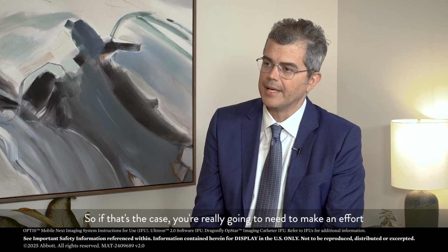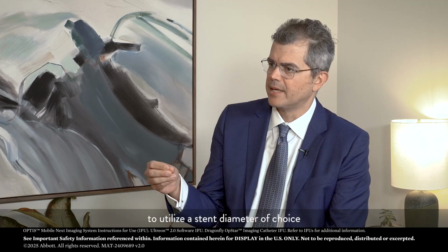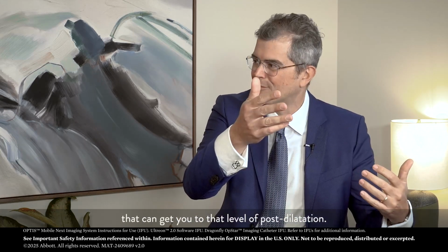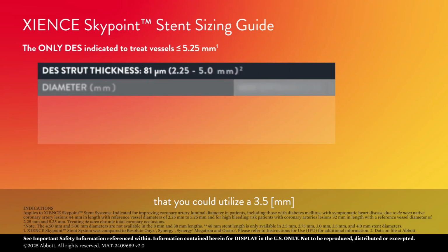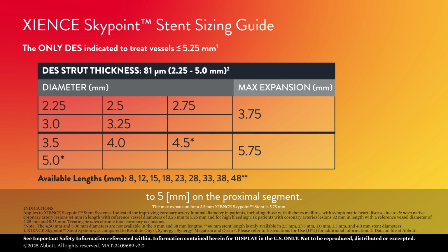If that's the case, you're really going to need to make an effort to use a stent diameter of choice that can get you to that level of post-dilatation. And hopefully you find a landing zone distal to the bifurcation so that, if you're using a Xience stent, you could use a 3.5 that would allow you to grow all the way to 5.0 on the proximal segment.